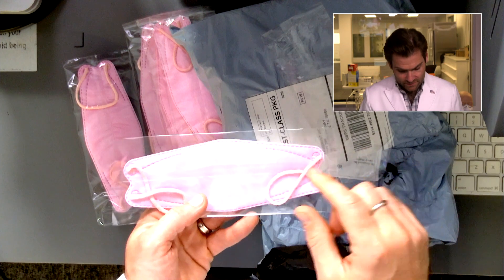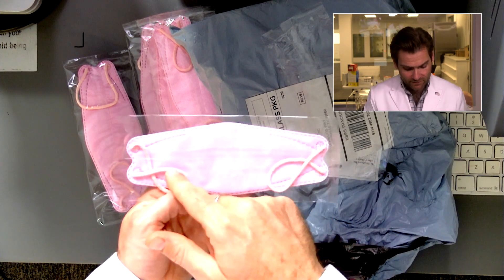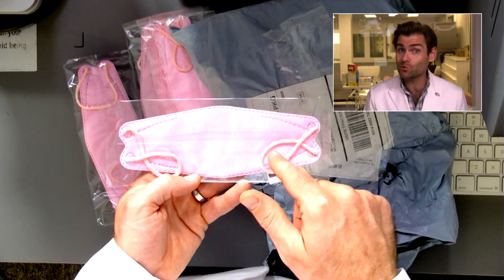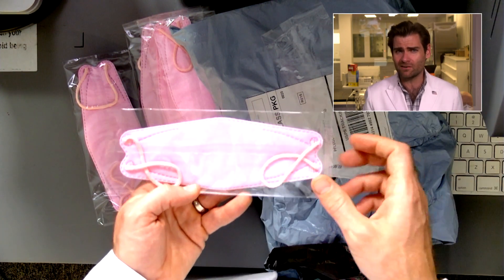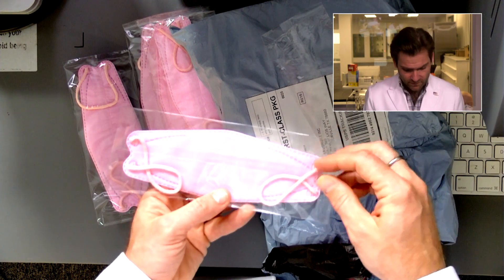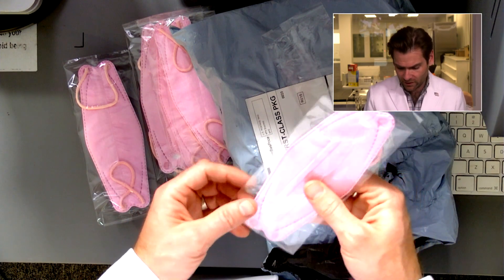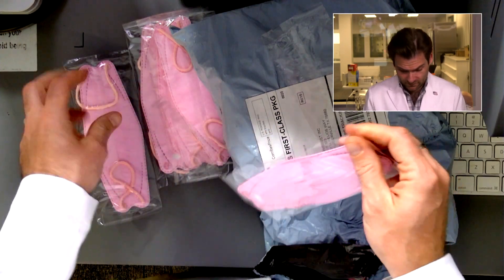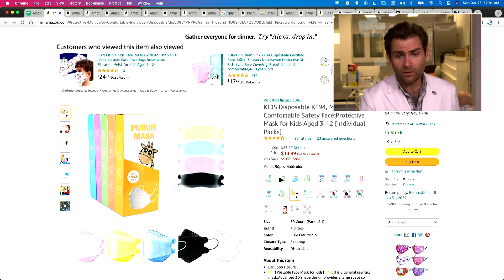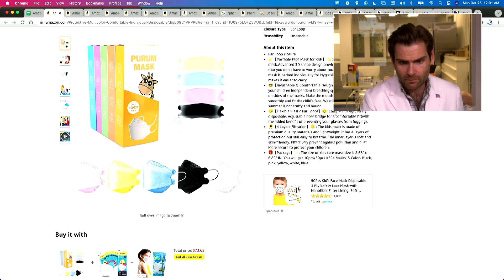Now, to be KN95, you've got to say KN95, you've got to say GB2626-2006 — which is weird because it's a super old standard. The current standard is 2019; that one was made in 2006. You also have to have the manufacturer name. You don't have any of those things. And on the listing, which may not be the manufacturer's fault, they're claiming to be a KF94 — which they're not, because it'd have to be made in Korea.